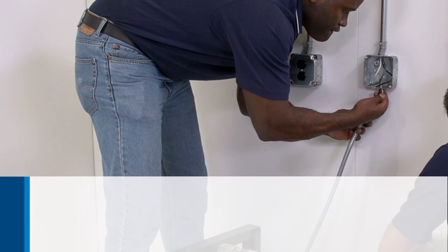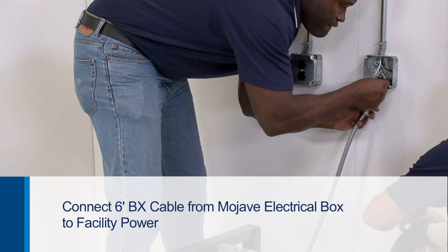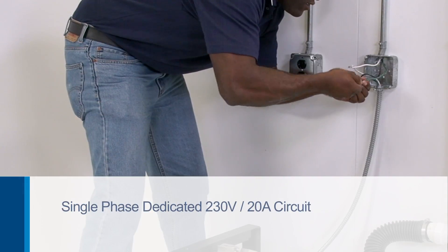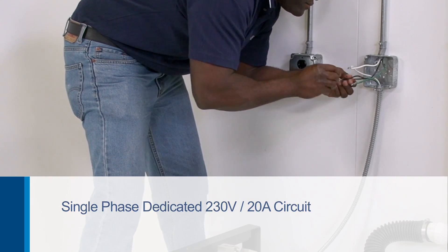At the same time, have the other installer connect the 6-foot BX cable from the Mojave electrical box to facility power — a single-phase dedicated 230-volt, 20-amp circuit.